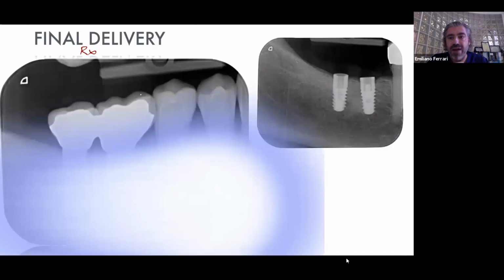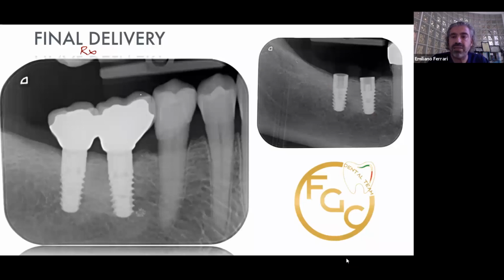So this is the final X-ray control, starting from a situation with two important mistakes: a broken screw inside the implant and an unknown implant.